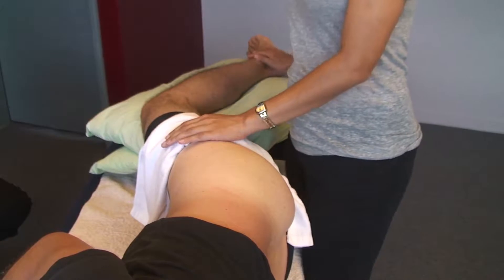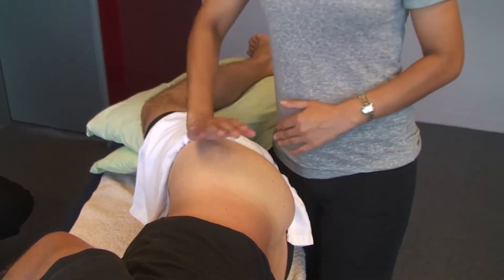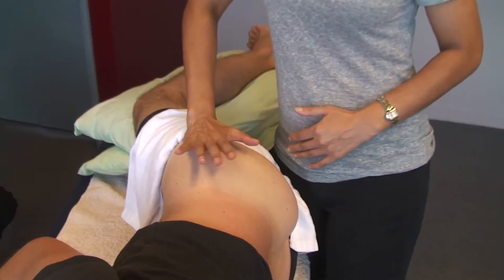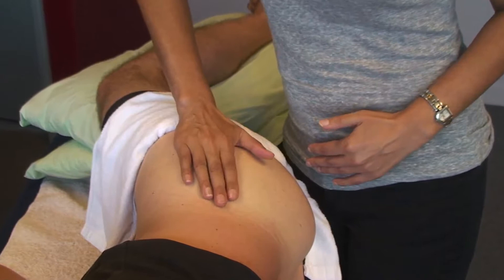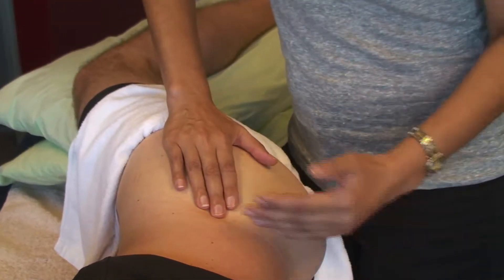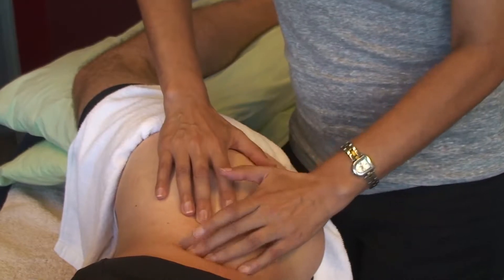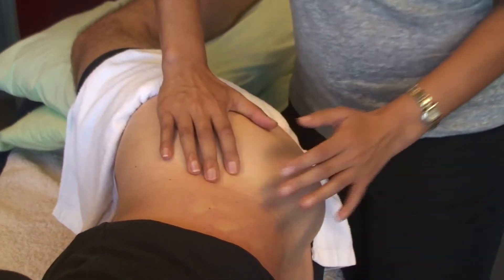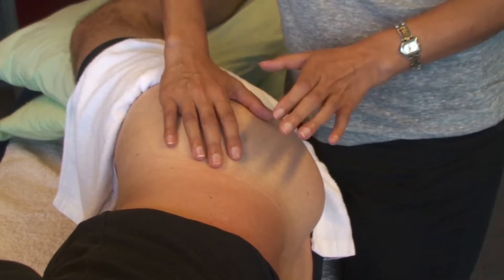You don't want their knees bent up too much. To find it anatomically, I put the heel of my hand on their greater trochanter and then spread my fingers over the glute medius, because the minimus is located under the medius, reaching towards the iliac crest. That's where I'm going to find it, and then I'll place the transducer head over that area.